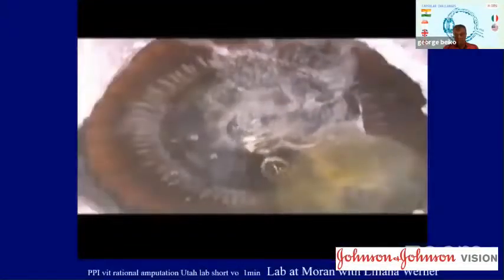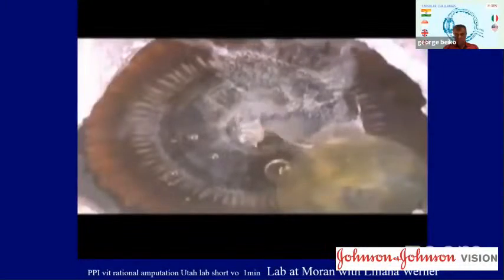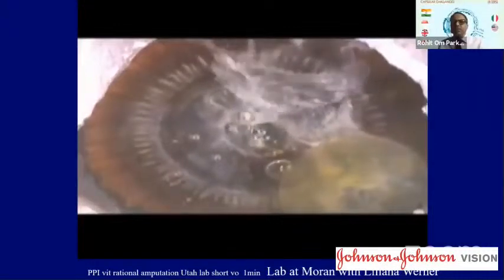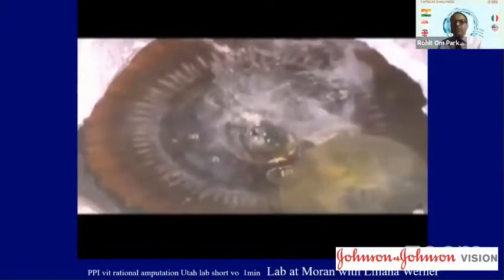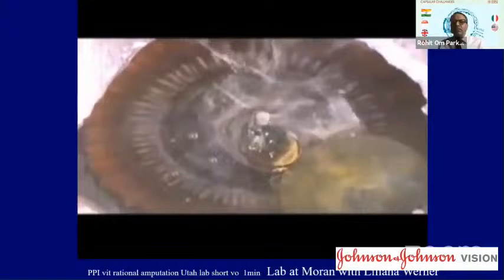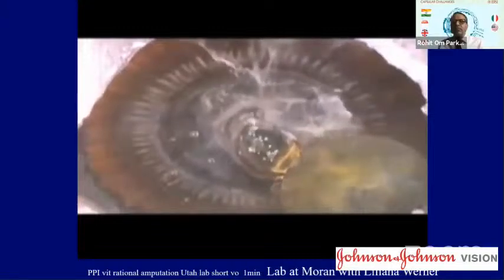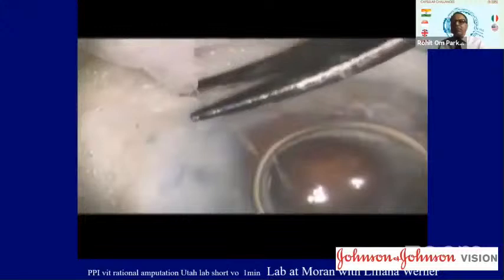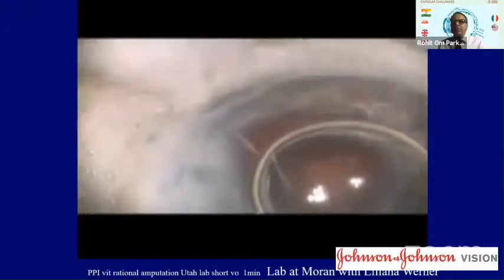This is me doing an anterior vitrectomy, with a clear corneal incision. And despite the fact that I'm putting the vitrector through the rent in the posterior capsule, you can see that as much vitreous is coming forward from the vitreous body as what I am removing anteriorly. And as we withdraw, there's often a wisp to the incision, as you might see at the slit lamp the next day.